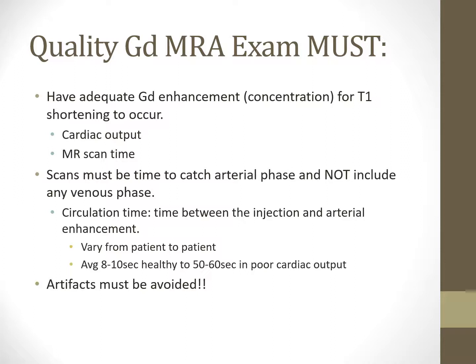We have a couple of considerations to take into account. One, it would be our patient's cardiac output, how healthy their little heart is functioning and pumping blood in and out, and how we're going to relate that to scan time. If our scan time is too short, we're going to have scanning time problems, and if our scan time is too long, we're going to have some serious problems as everything is going to be enhanced. So we kind of have to hit that perfect time mark.